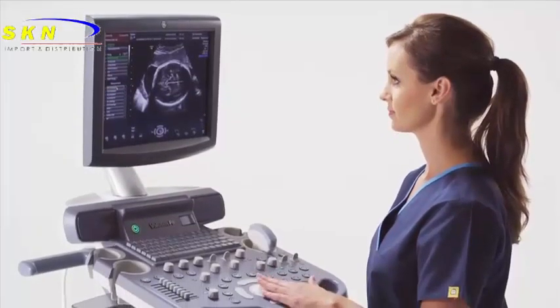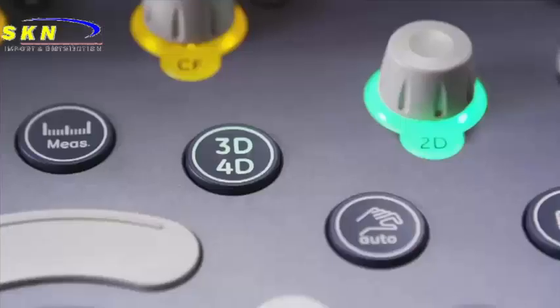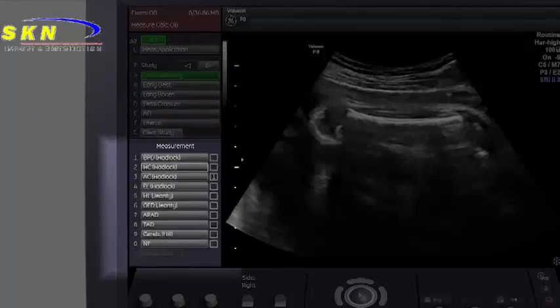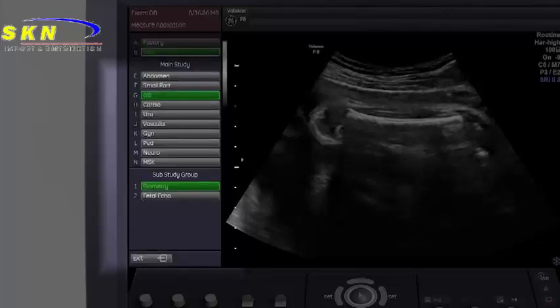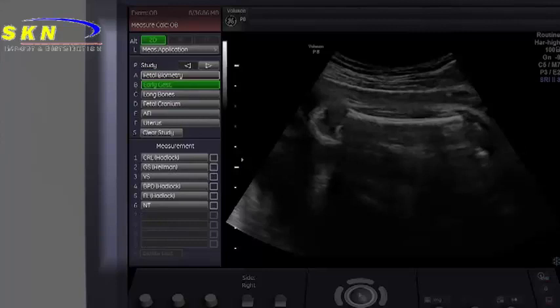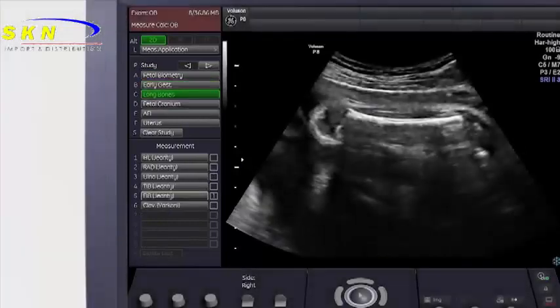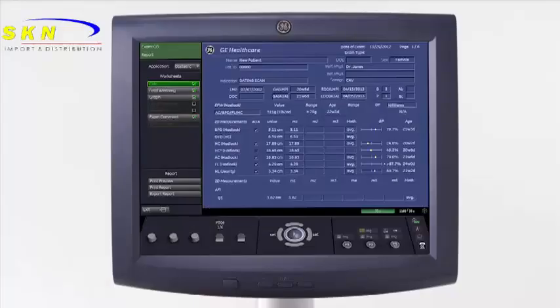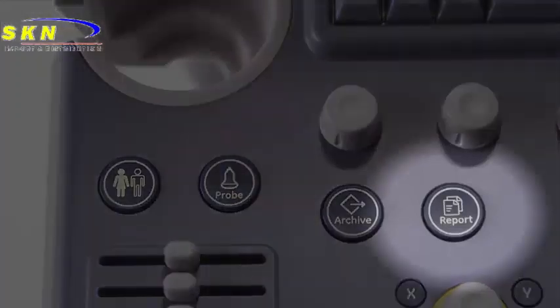Measurements are also performed using trackball and set functions. When the measurement hard key is selected, a customizable list of measurements appears on the display menu. The menu choices are based upon the application used. For example, in the OB application, the OB measurement package will appear. The top of the menu shows various subcategories in the application, and the bottom shows the actual calculations to be chosen. Generic measurements can be done by selecting the measure key again. Completed measurements will be sent to the report and can be accessed by selecting the report hard key on the console.